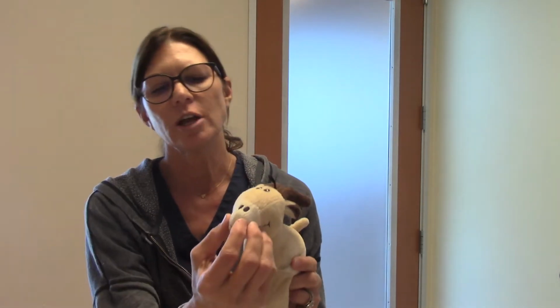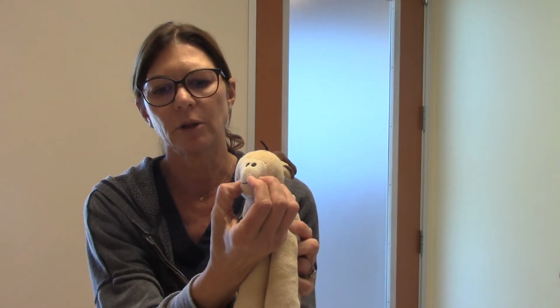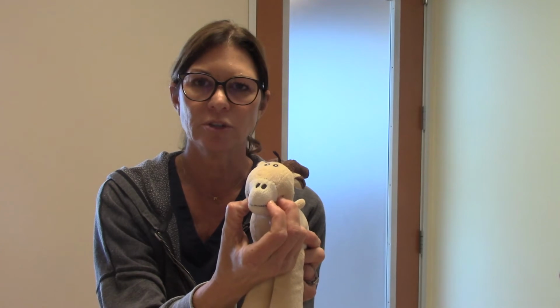Jaw tone. Jaw tone is when you can put a bit of pressure on their jaw and actually open it without them fighting you too much. When their jaw tone is slack enough, you're able to move forward with the intubation.